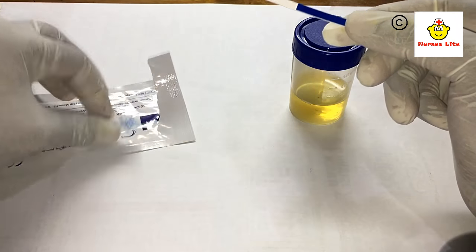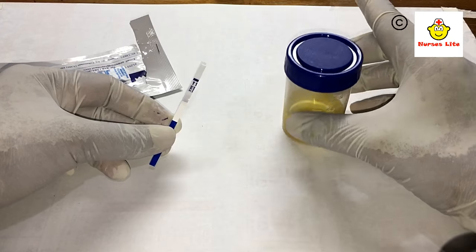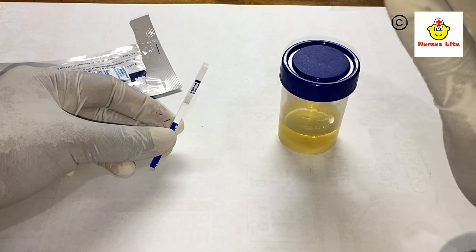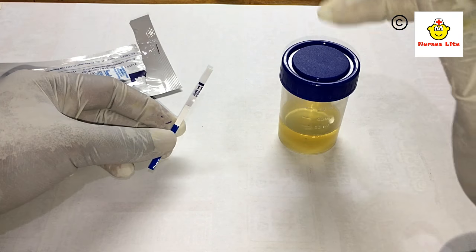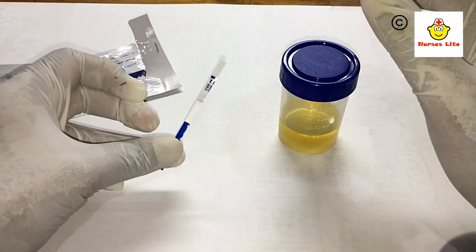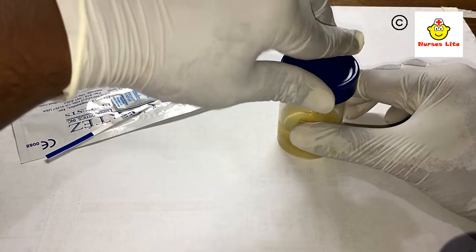There is no need for any special container. If you have a clean plastic cup, you can use it as a container, because the container type does not influence the result. First, open the lid of your urine container.